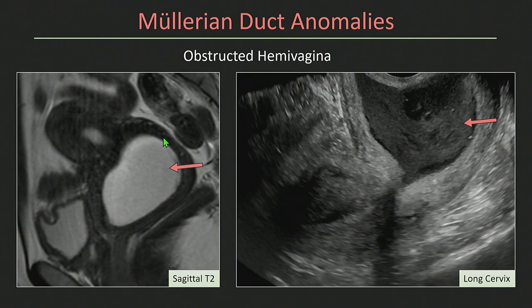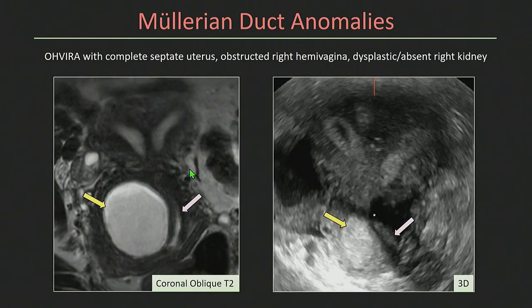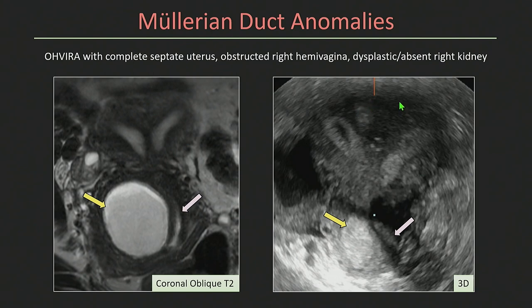Here's the correlative MR imaging. On sagittal T2-weighted image, you can see the big fluid collection in the area of the vagina corresponding to the clot in the obstructed hemivagina. On coronal oblique T2, when protocoled appropriately for Mullerian duct anomaly protocol, we try to get axial or coronal oblique images to see the top of the uterus. You can see the top of the uterus is smooth, there's indentation of the endometrial cavity, a fibrous septum, the obstructed hemivagina on the right, and the normal vagina on the left. The reason I show a lot of MR throughout this talk is because the 3Ds are really hard on ultrasound.